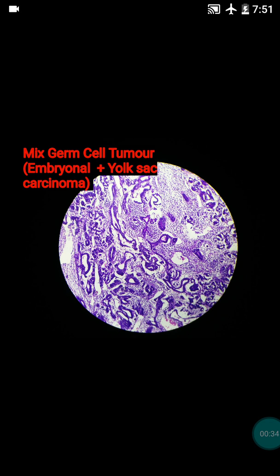Around 95% are germ cell tumours. The most common one is the seminoma, which usually presents in the young age group. Another group of germ cell tumours are the non-seminomatous germ cell tumours, which include choriocarcinoma, teratoma, embryonal carcinoma, and yolk sac carcinoma. Our case was embryonal carcinoma plus yolk sac carcinoma mixed germ cell tumour, classified under non-seminomatous germ cell tumours.